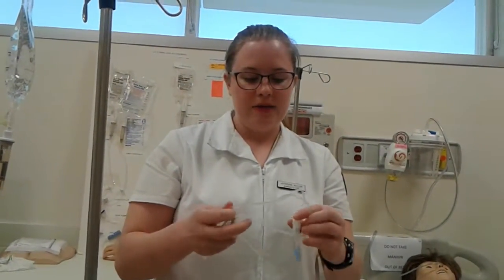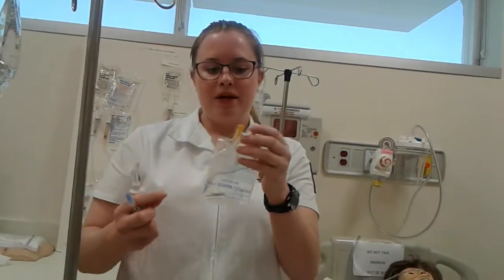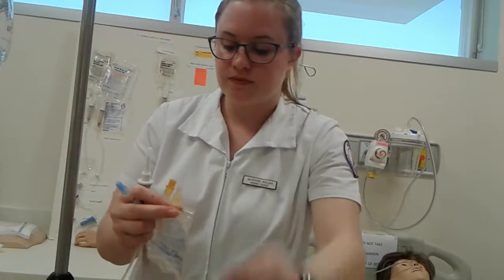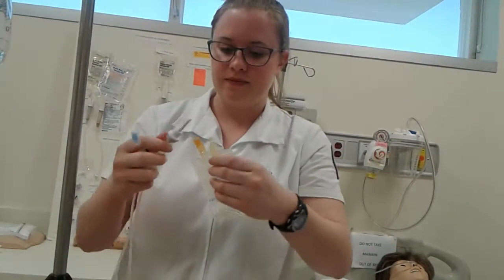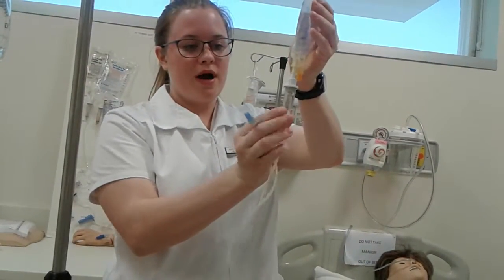So I have my IV piggyback tubing, and I would need to clamp the tubing so it's completely closed. I'm going to take my medication and open the cap. And now that the sterile field is set up, along with my spike cap, I'm going to spike the medication while filling the drip chamber to about halfway.